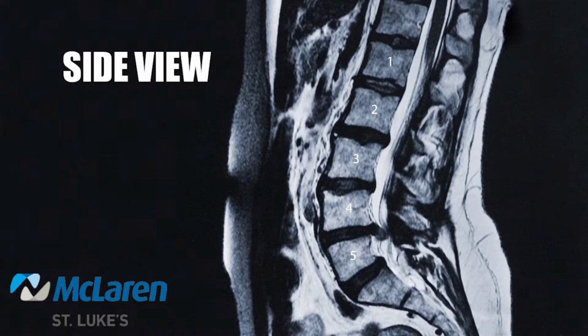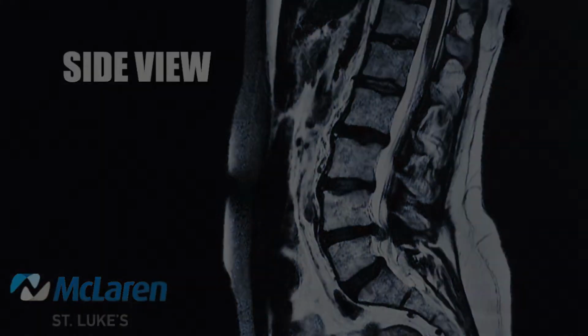Now you can see between the 4th and 5th bone, there's a herniated disc, which is represented by this dark structure here. And the herniated disc has herniated backwards into the spinal canal and is pinching the nerve. So this is a good example of a herniated disc between the 4th and 5th bone of the lumbar spine.